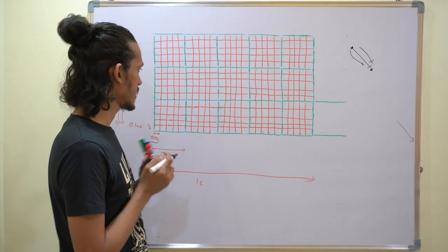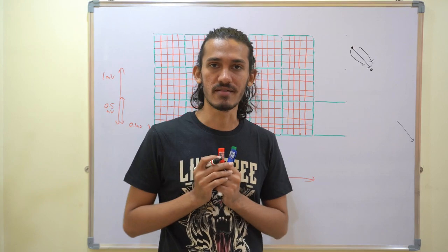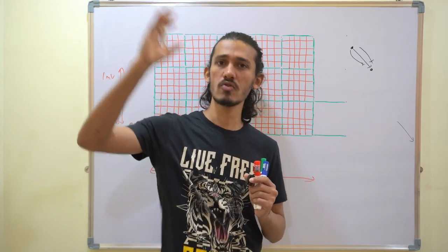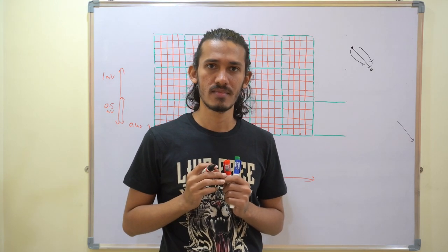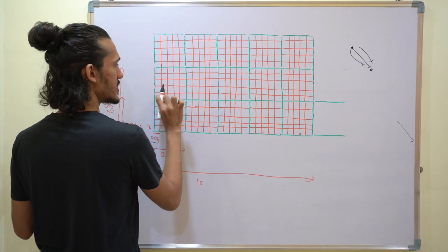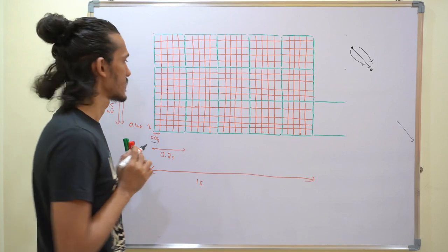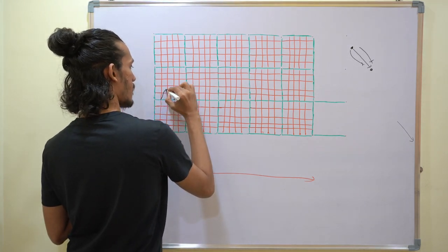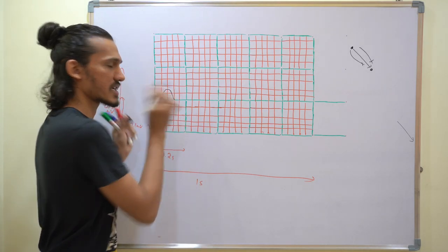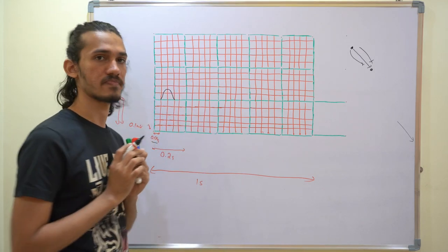Okay. How about the amplitude? Amplitude is also 1 to 3 divisions. So in amplitude, 1 to 3 divisions would be 0.1 to 0.3. We'll take an average of 0.15. So this is 0.1, somewhere here is 0.15. So that is your P wave. You get the picture? Duration of 2 to 3 divisions, and amplitude of 1 to 3 divisions.